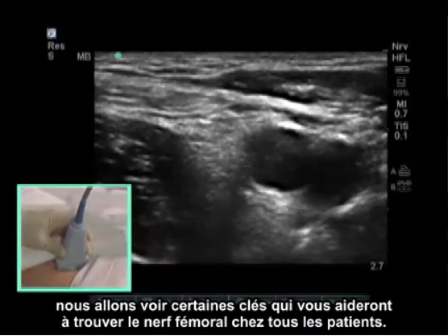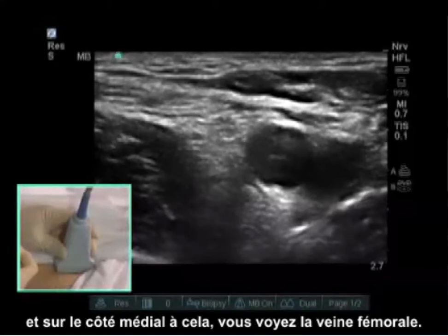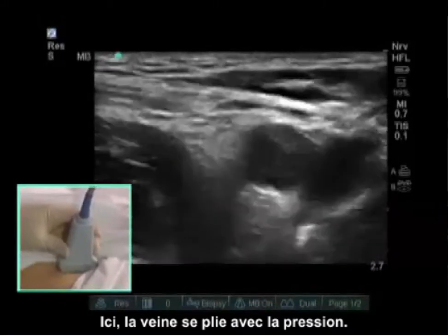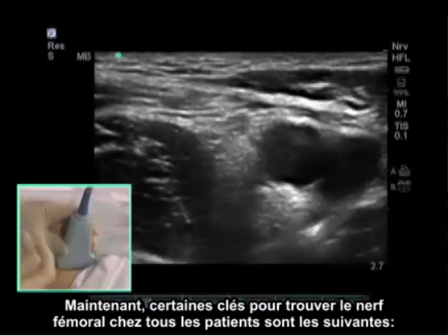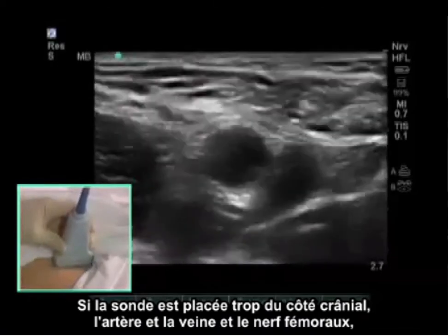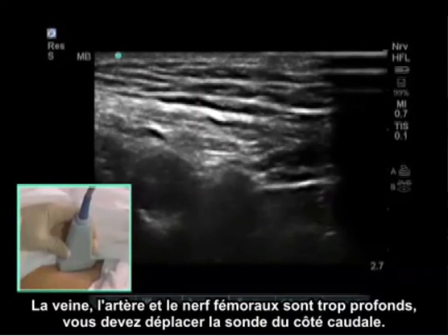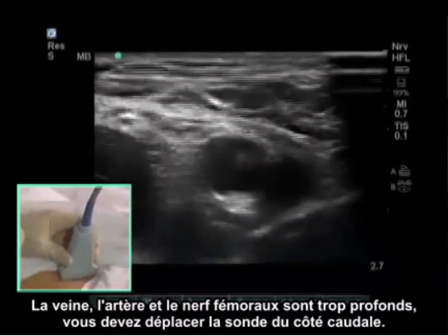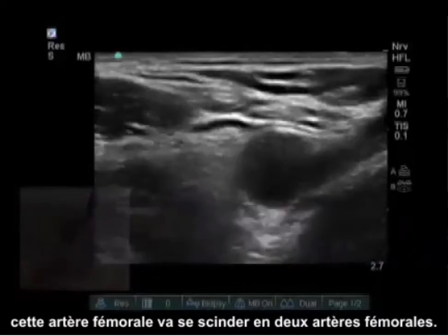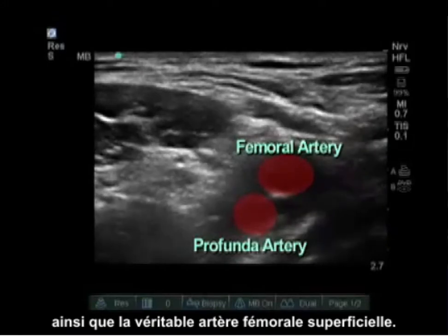As we move up and down the leg, there are some keys that will help you find the femoral nerve in all patients. More medially, you see the pulsating femoral artery, and medial to that, the femoral vein — the vein collapses with pressure. If the probe is placed too cranially, your femoral artery, vein, and nerve drop deep on the screen, so you need to move the probe caudally. If your probe is placed too distally, the femoral artery is going to split into two femoral arteries — a pulsating profunda femoris deep as well as a true femoral artery superficial.